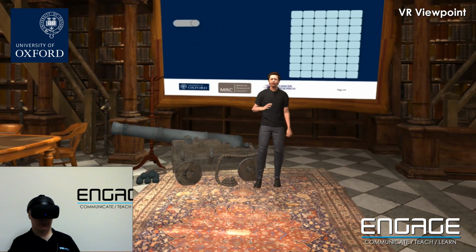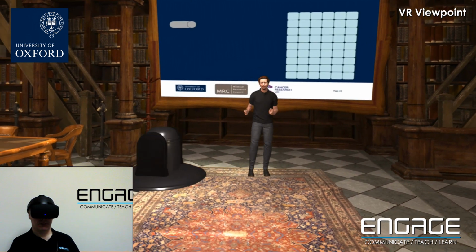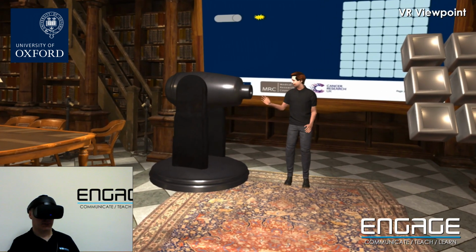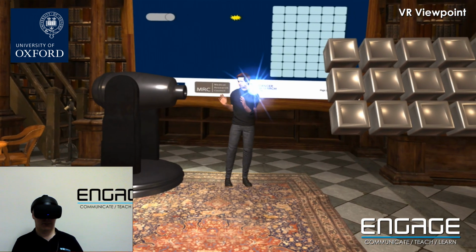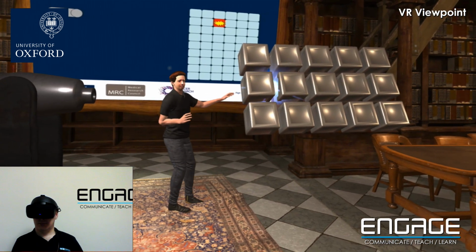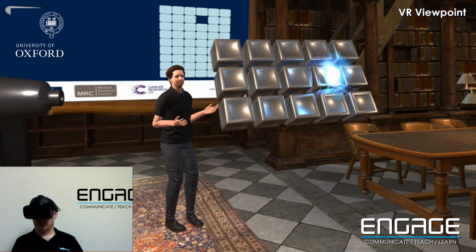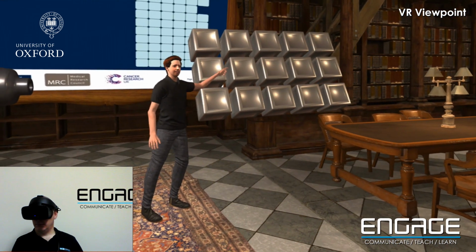Unfortunately, weird stuff happens when you get really tiny. The photons, the X-ray bits, the little packets of energy that come out of an X-ray gun are so small that they're entitled to behave a bit weirdly. So if we fire this gun, out comes a little packet of energy. The packet of energy flies through the air towards the patient. But instead of hitting and knocking bits out of the first brick it encounters, it can knock energy out of maybe the third brick it encounters. And that will damage that space. It could do that, or it could knock out of the fourth brick, or even the last brick.